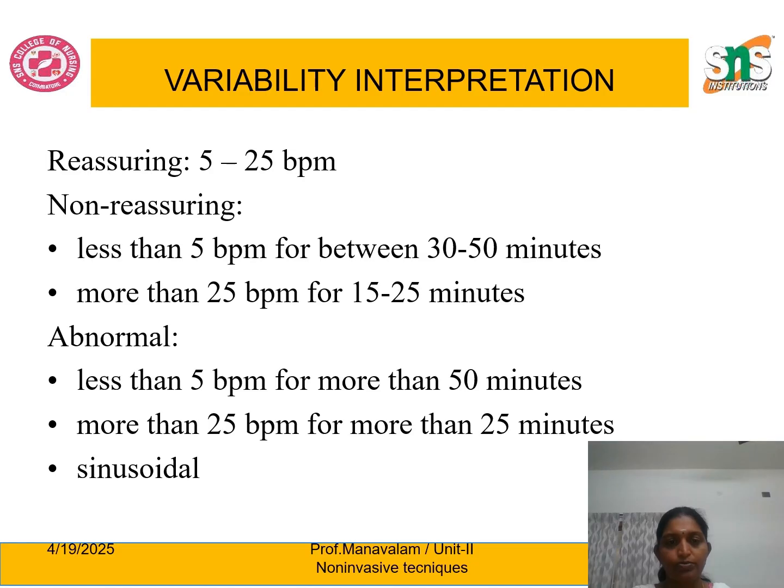Next, move on to the abnormal. Abnormal indicates that it is completely abnormal. So the fetus has some severe type of problem. So immediately we have to concentrate more on it, actively manage the situation, and deliver the baby in order to save the life of the baby.